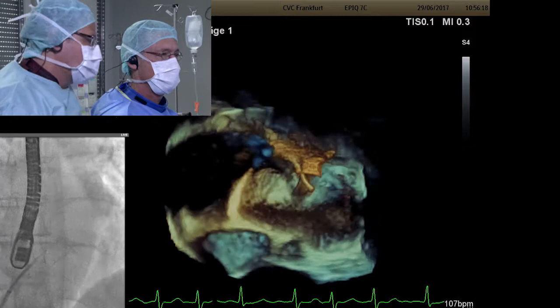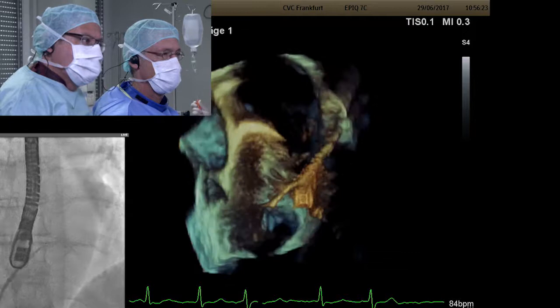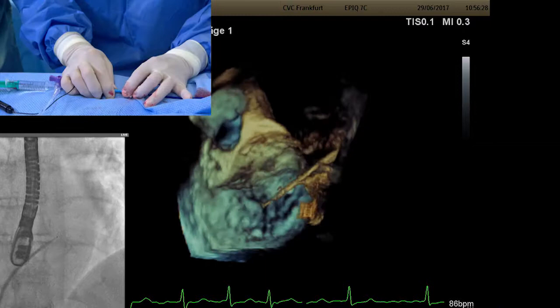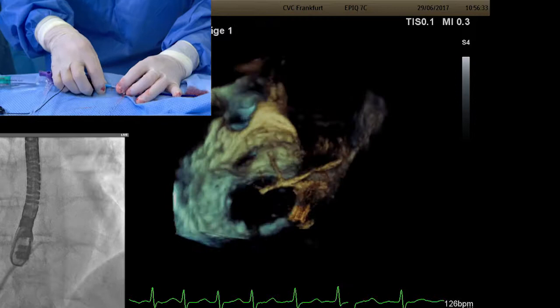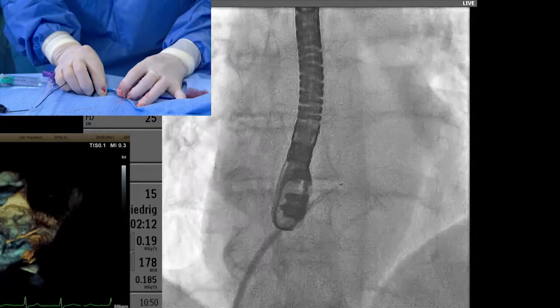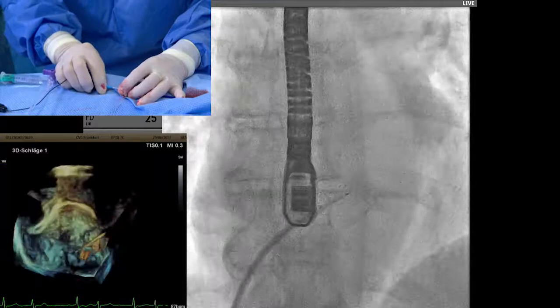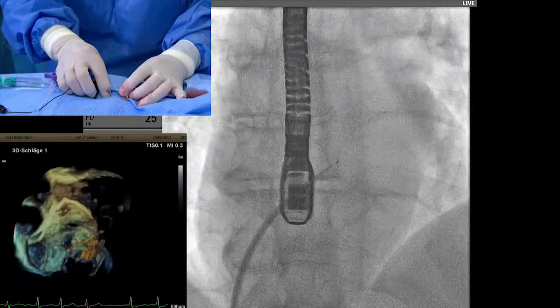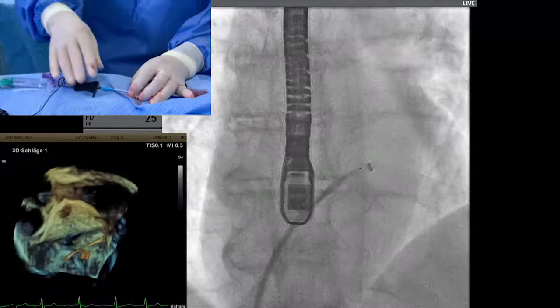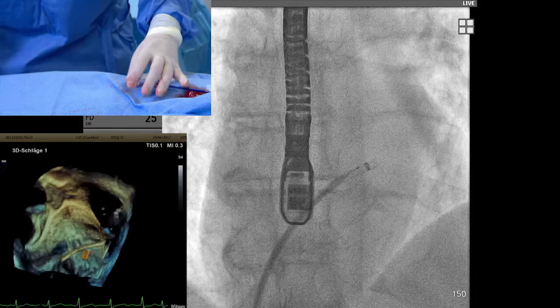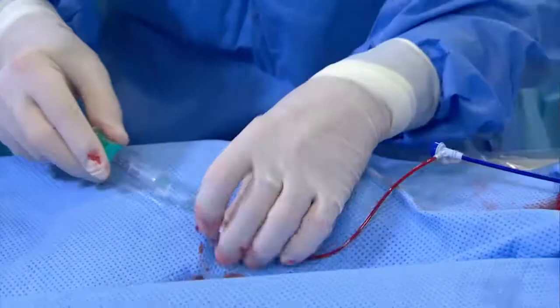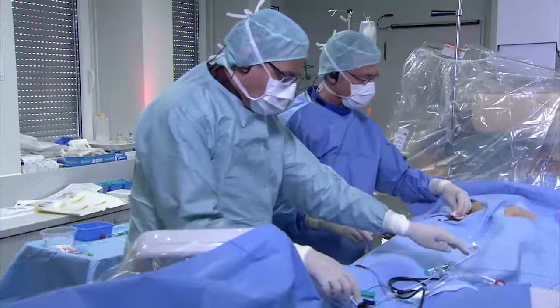One advantage of the RF system is the blunt tip, which reduces risk of puncturing the opposite wall. The system works well, though one would prefer distal opening to allow wire introduction. However, every system has advantages and disadvantages. Now we are across and we can give heparin. I always give 10,000 units for LAA closure as a standard dose; if the procedure takes a long time, we measure ACT, but not routinely.